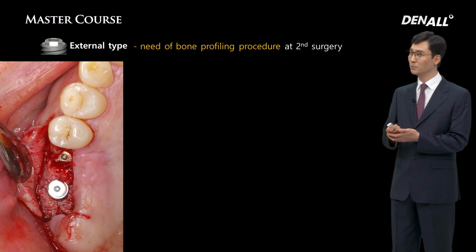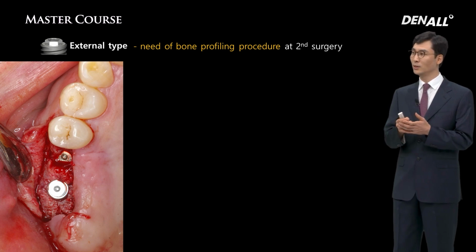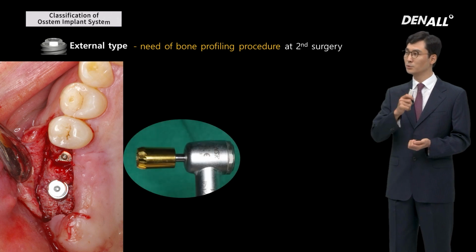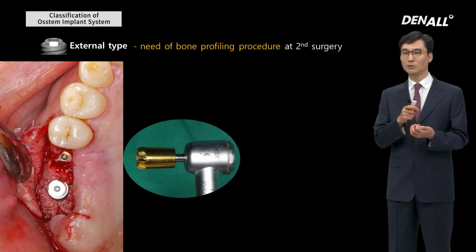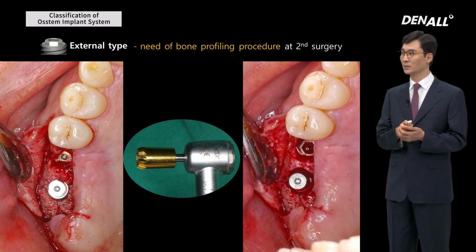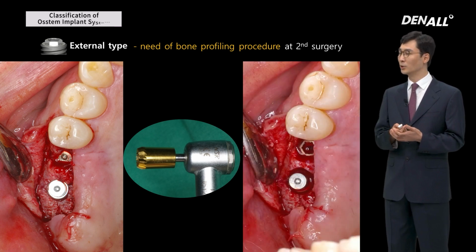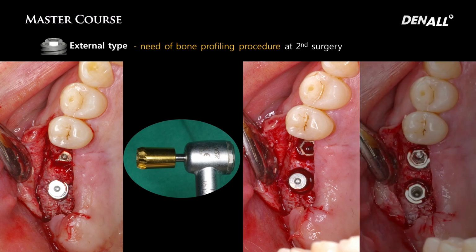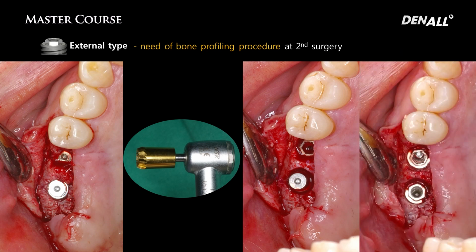As mentioned before, US implants are submerged with a 2-stage approach. A cover screw is removed, and when a healing abutment is connected directly, the bone interferes with that. So using a bone profiler drill, the surrounding bone should be reduced, and the platform should be completely exposed for the second surgery. So this is a difficulty with the surgery.